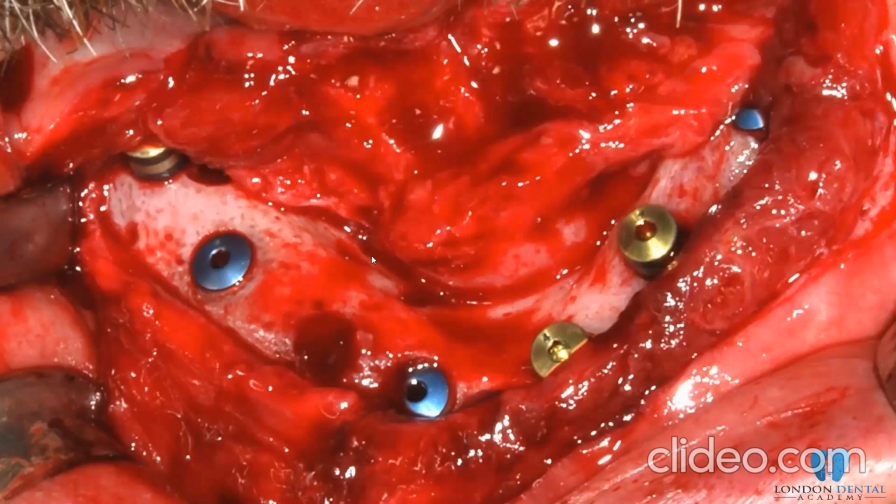The take-home message here is: don't trust surgical guides in fully edentulous cases, especially with severe resorption. You can trust them in dentate and partially dentate patients, with tooth-fitted guides. With gum-fitted guides, please try to avoid them at least at this stage, because you never know the position. Even with full dentures we use them as a guide, it's always hit and miss, but at least we know we are within the prosthetic envelope and then we open a flap. So if you want to use them, you still need to open a flap at the end and look at the implant sites.